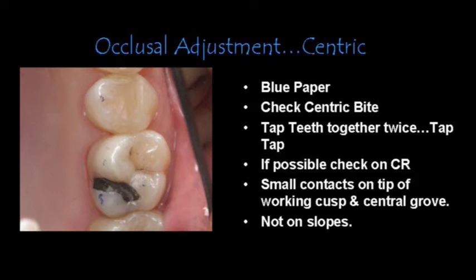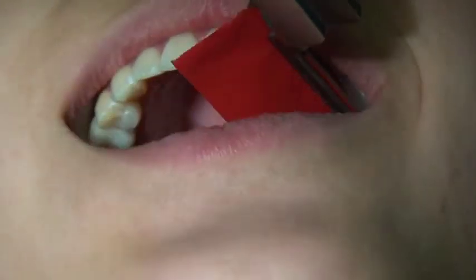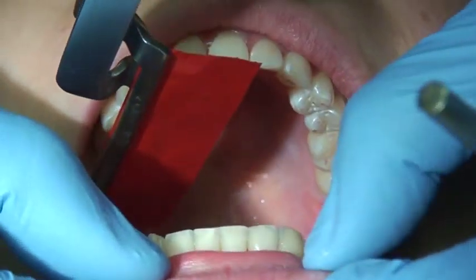We don't want to forget the next step because we know that people don't chew like alligators. They don't just chop, chop. Their mandibles grind to the side in the direction of the food. Everybody does that. And we must mark those lateral movements and lateral interferences. And as you can see in this video, we use the red paper. And the instructions for the patient is to chew or grind their teeth together.